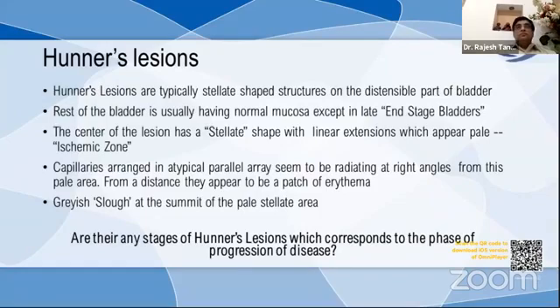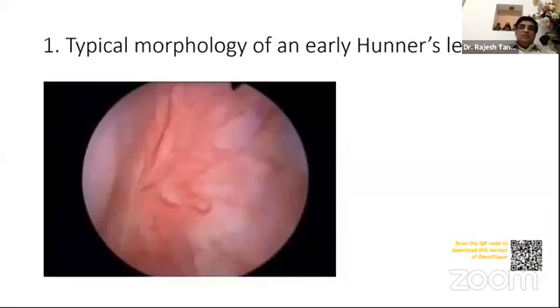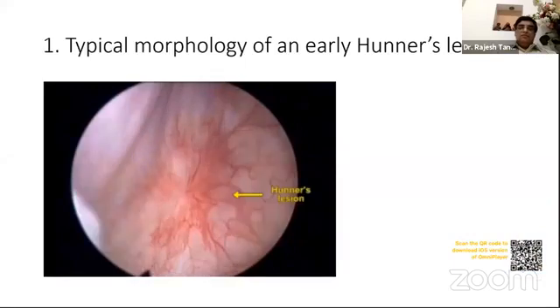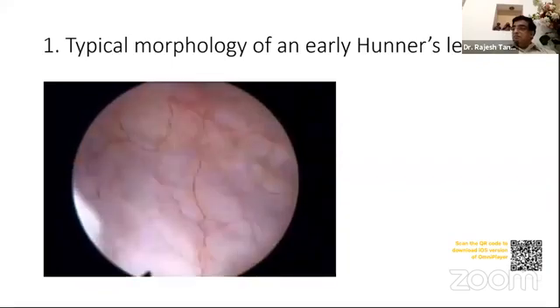Are there stages of Hunner's lesions corresponding to the phase of disease progression? This is a typical Hunner's lesion in an early disease where the rest of the bladder is healthy, compliant, and well distensible.